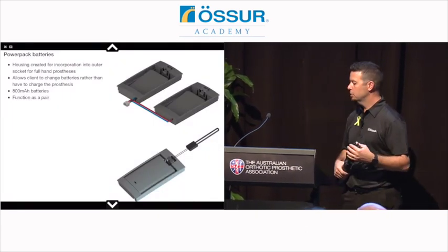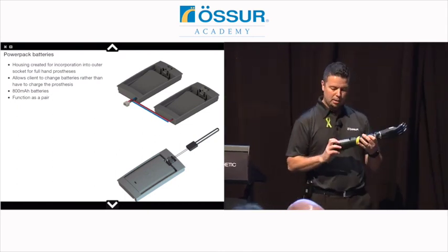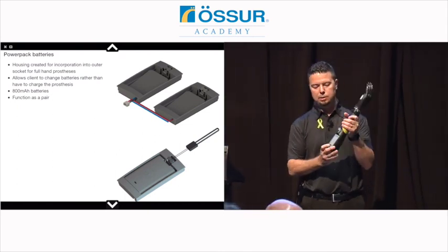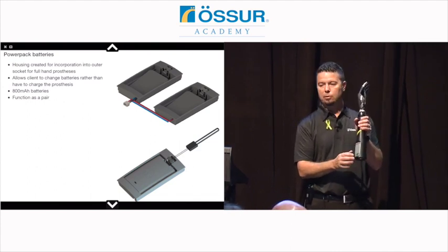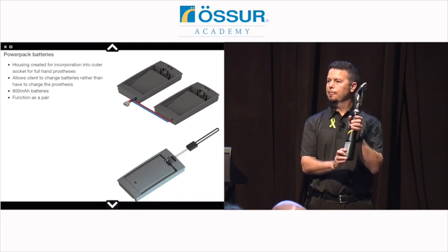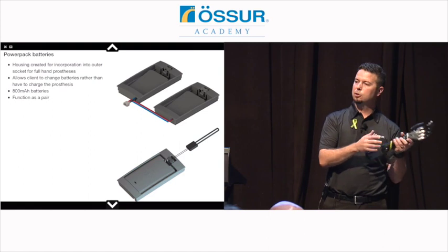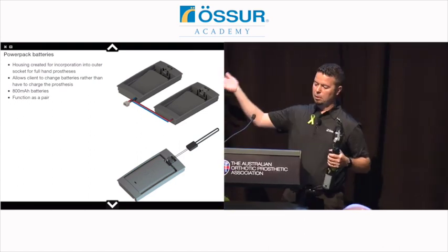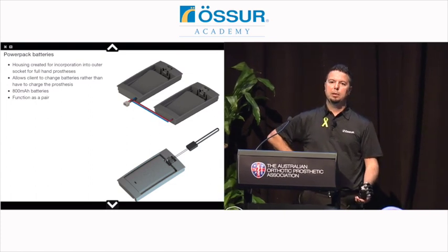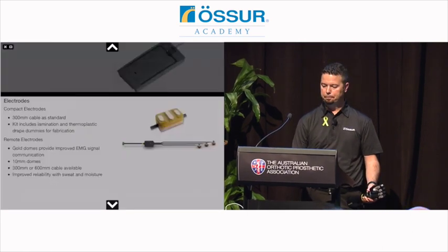Another option, we have external batteries. They are what we call power pack. I'll be quite honest, I'm not a huge fan of them because you can see the form factor that they take up. You do need 2 of them, and they're only 800 milliamp hour. The advantage is that you can switch these out and you don't have to take the prosthesis off and charge them. So it is an option. If you have somebody that maybe they're away from a good place to charge a system, or they can't be without the hand for any period of time, this is a good option as well.